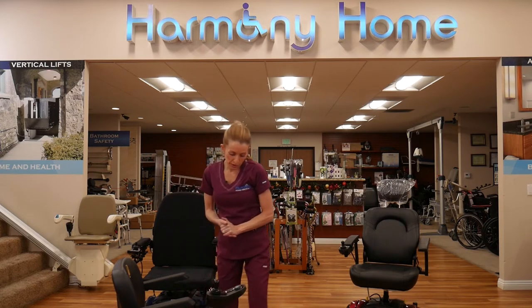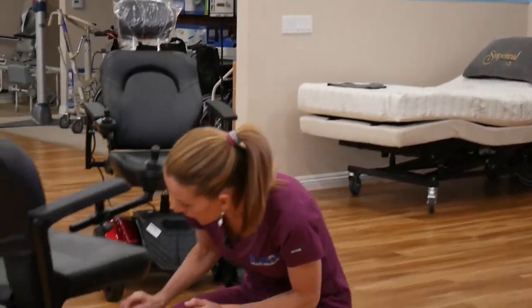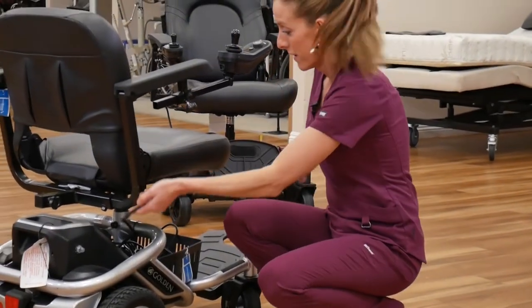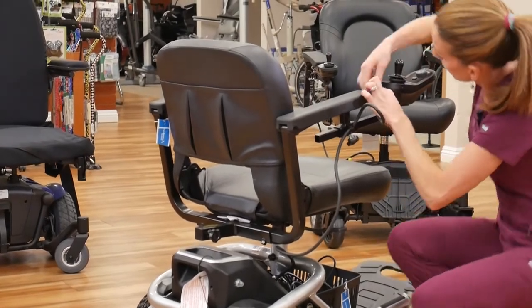That's pretty much it for how we disassemble these. We also want to plug the joystick back in — that last little piece — and then you're on your way.